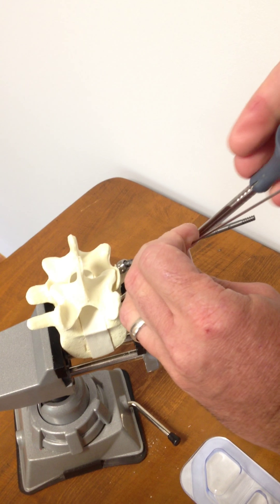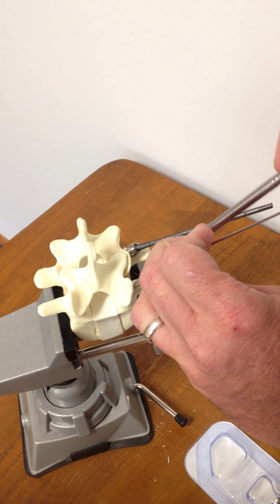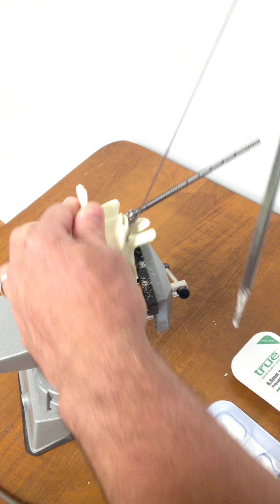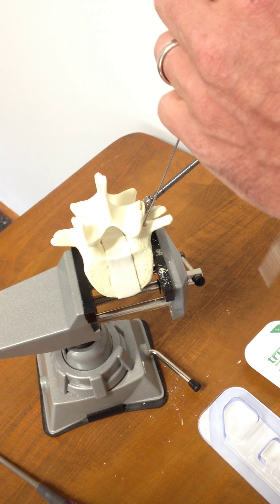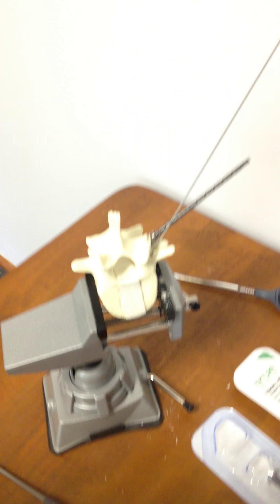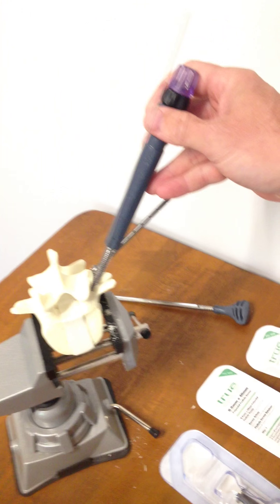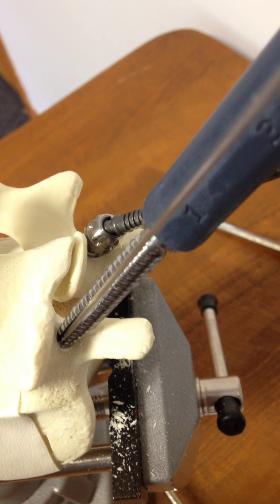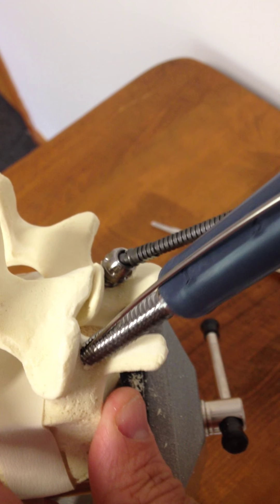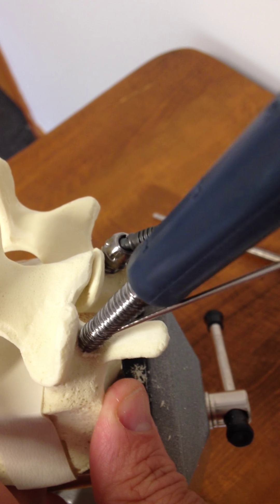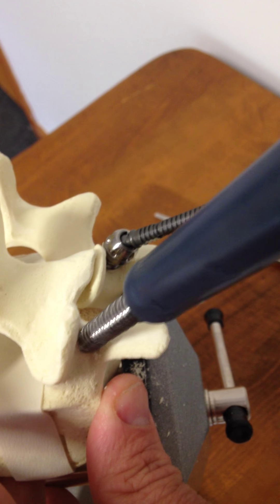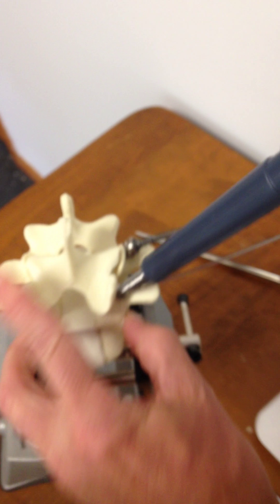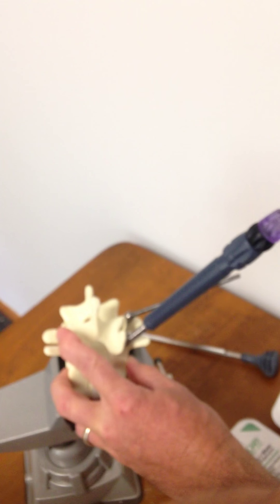Again, placement of the K wire down and in. Keep nice downward pressure, allow the K wire to seat. And then the second screw placement comes in place here. Let me take a close look there. Again, about three rotations here allows our thread to get well seated and then also allows for easy removal of our K wire delivery wire.